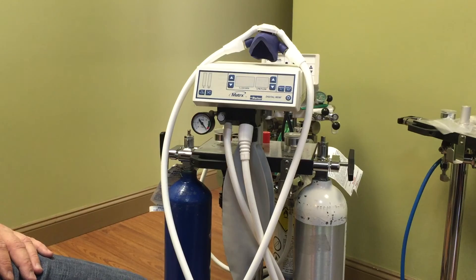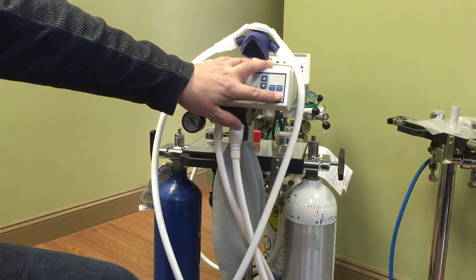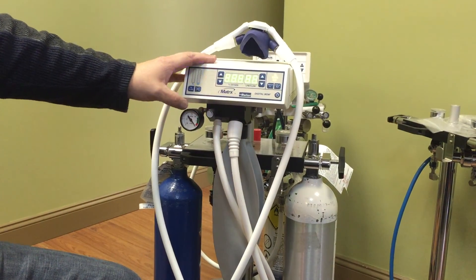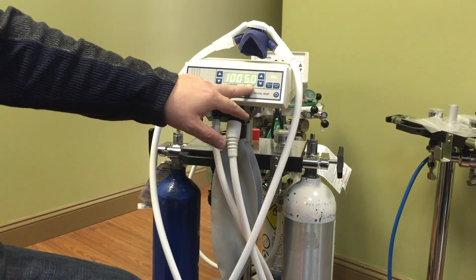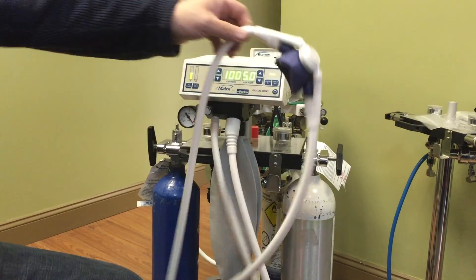Once that's done, your patient comes into the room. You can sit them down in the chair, introduce yourself, and do your regular routine. The nitrous oxide unit, you power up after that, because once you power up the nitrous oxide unit, it starts to flow 100% oxygen at 5 liters a minute. This is when you put the unit on the patient's face.